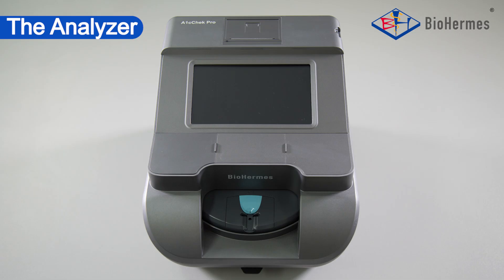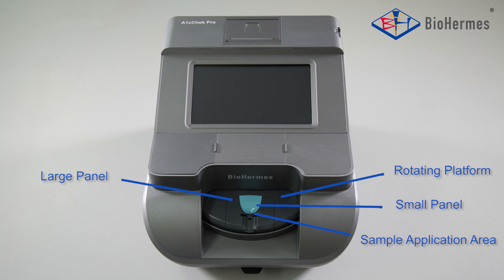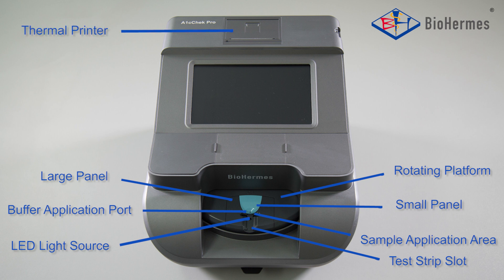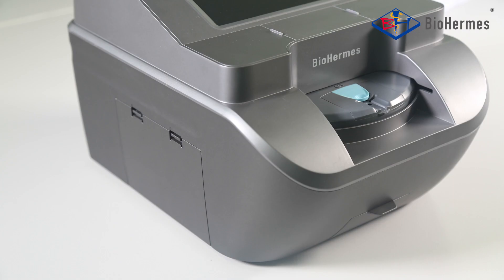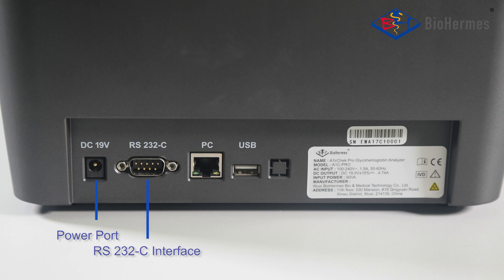The Analyzer consists of: Rotating Platform, Large Panel, Small Panel, Sample Application Area, Buffer Application Port, Test Strip Slot, LED Light Source, Thermal Printer, Cold Chip Slot, Touch Screen, Waste Tank, Buffer Bottle Chamber, Power Switch, and Power Port.